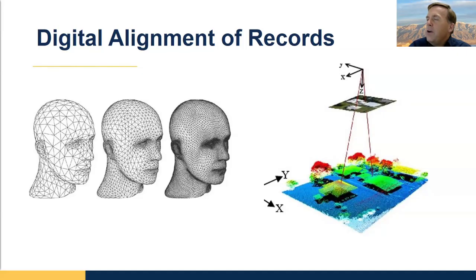As long as we don't deliberately change it, that bite is an intrinsic part of the file. So if I import the upper and I say import the lower in the same position, that bite will, 100 times out of 100, be correct. What you'll see in our digital denture workflow is sometimes we have to stack a bunch of files.